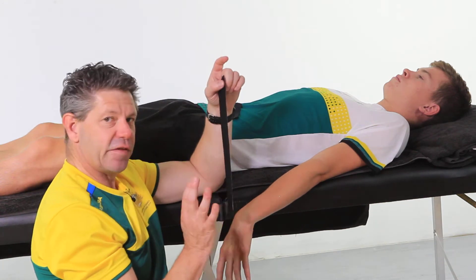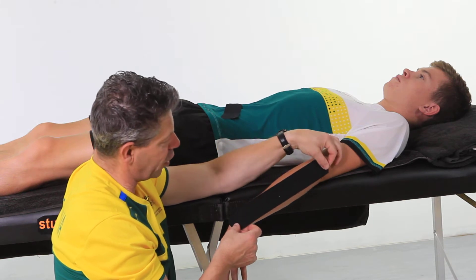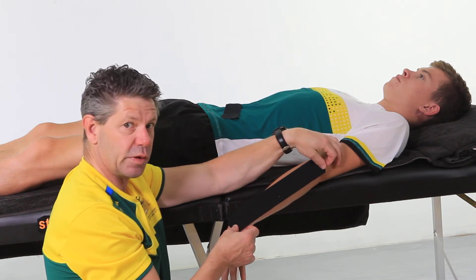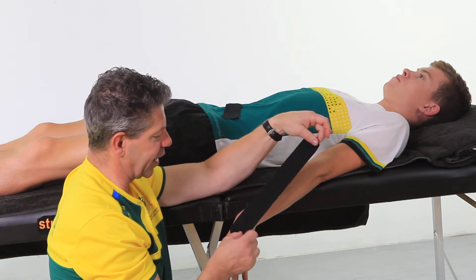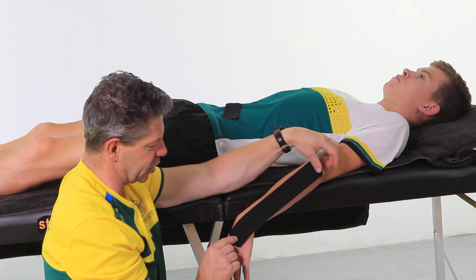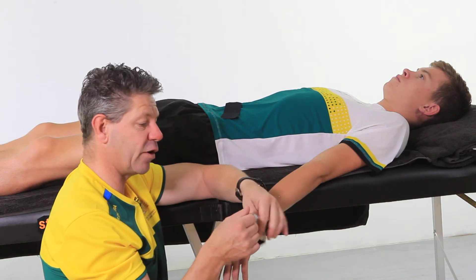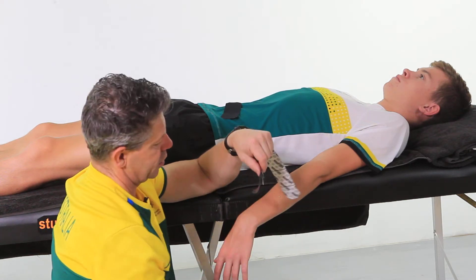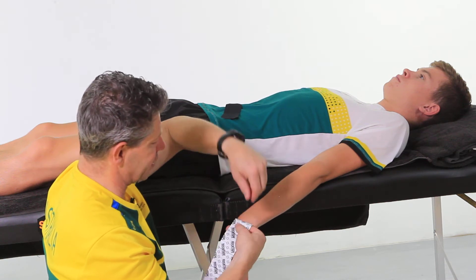Very simply, this is a very simple approach because basically all we're doing is stabilizing right along the length of the extensors, and then we're going to decompress where the site of the pain is. It's actually really quite simple. It's just a matter of getting the length of your tape right. You want to come just short of the epicondyle and just a little past the wrist, because we want to use the back of the wrist as our anchor point. So just tear off your anchor and place that down over the back of the wrist itself.